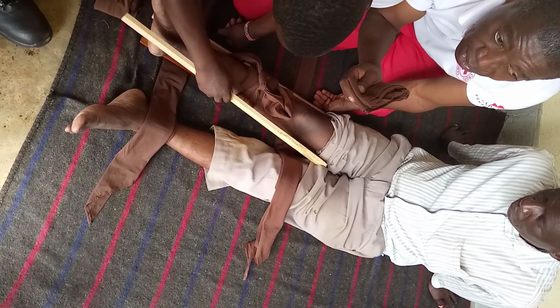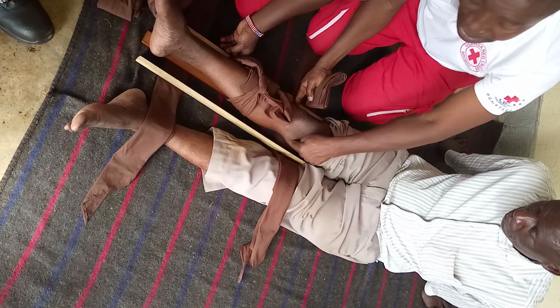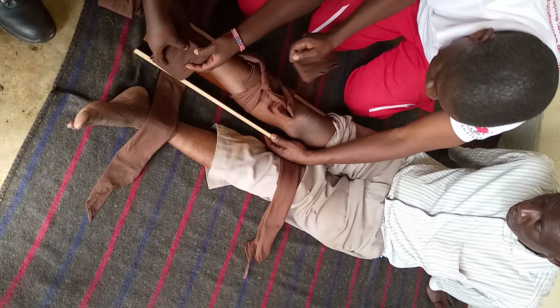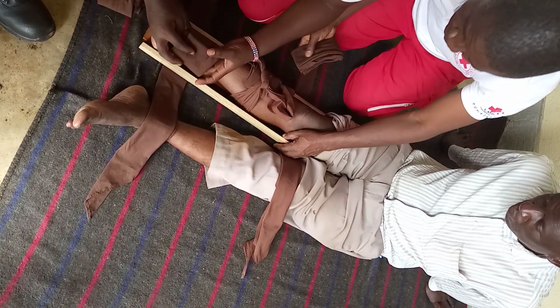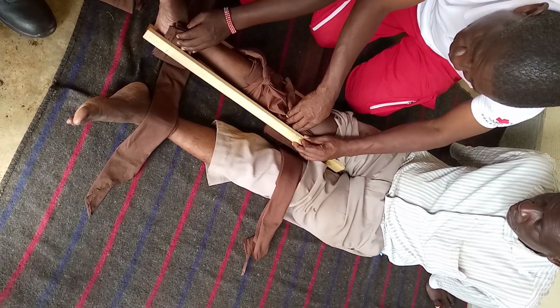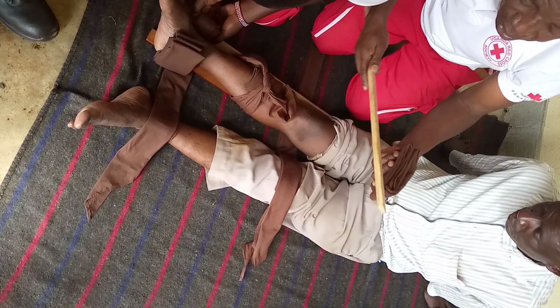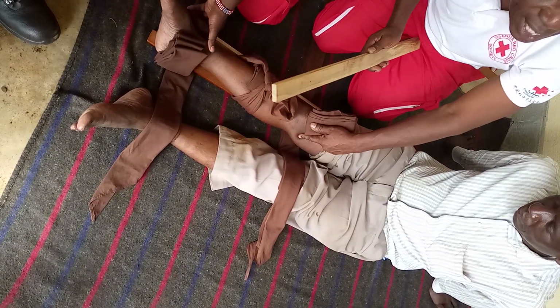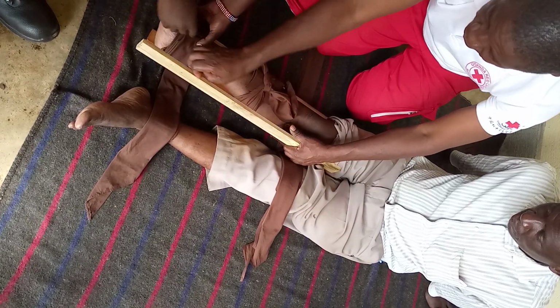remember to apply a lot of pads at the bone areas. These are bone areas. If I put here this splint and even this part, this person will feel uncomfortable. It will be painful. Is it clear? So what you do, if you have enough of this, you do this. For us, we have enough, we shall do it. But if you don't have, you can improvise. You can get one fixed inside here so that it can help you here and there. You get it? So you just have to use your logic.